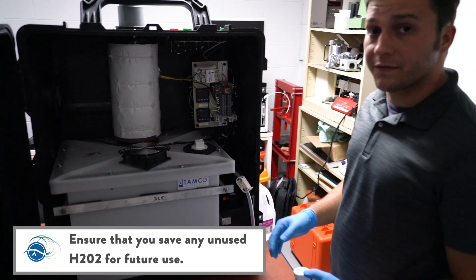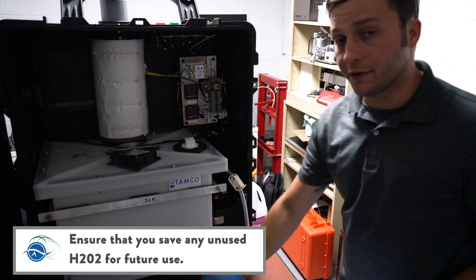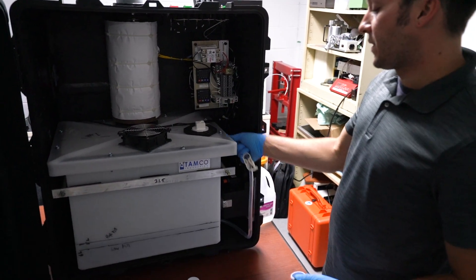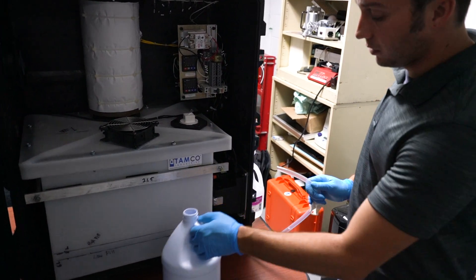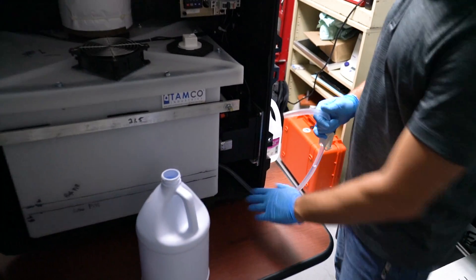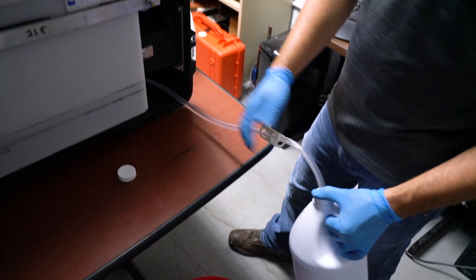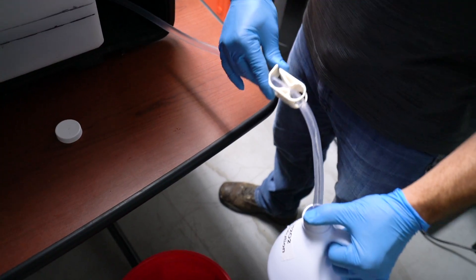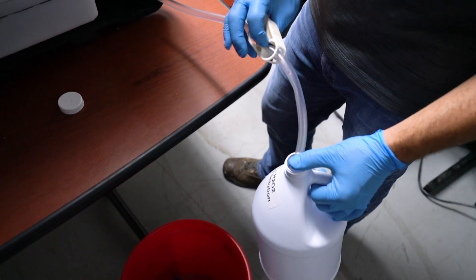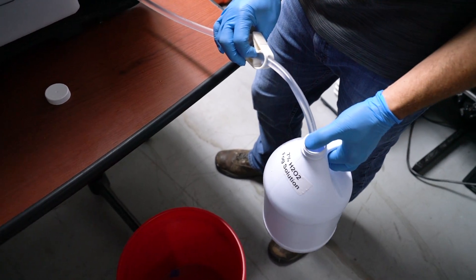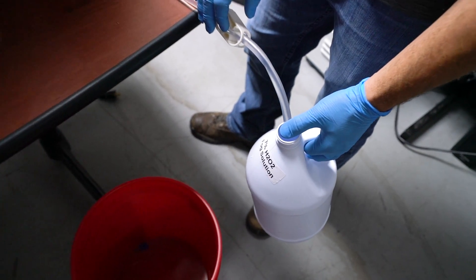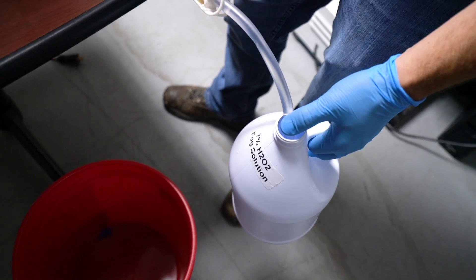At the end of each disinfection procedure, you want to drain the solution from the reservoir tank. To do so, you will locate the drain hose on the right hand side of the reservoir tank and disengage the safety clip from the hose. Direct the solution into an appropriate container. This solution can be reused at another point.